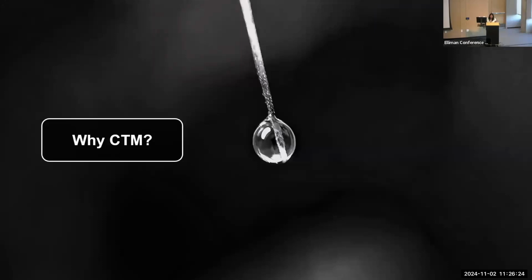So you've just heard from Dr. Lutzen about DSM, and I'm going to talk to you about dynamic CT myelography. And this is the main method I use to locate spinal CSF leaks. And I find it to be very successful. And why do I use it? Well, partly it's the imaging test that I have the most access to. So that's the one that I've been able to build up the best experience with and evolve and refine the technique. But there are other reasons too, and we're going to cover that in this talk.